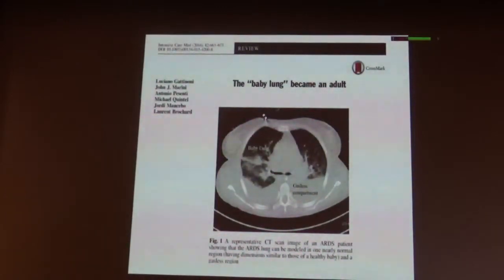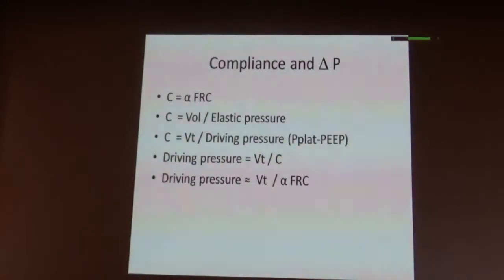It's the complete lower lobes which are atelectatic here. So we are really ventilating only 30% of a normal lung. And we now have tools at our disposal at the bedside, not very complicated to measure, which tell us important information about what we set on the vent and the interaction with the patient.